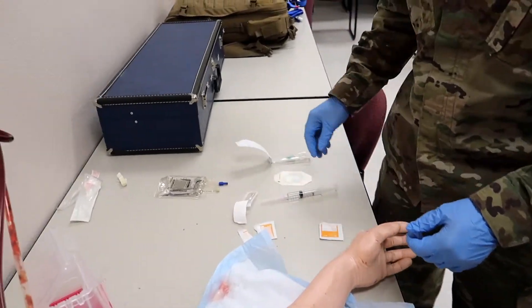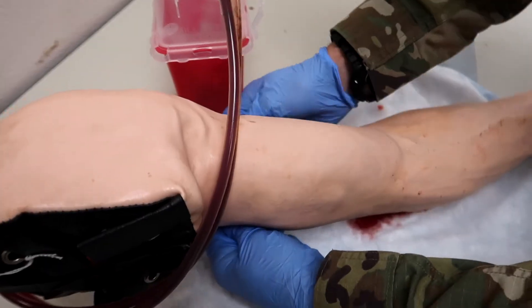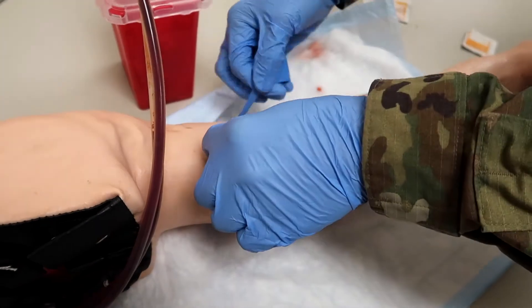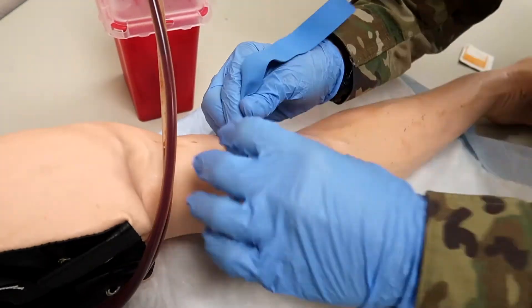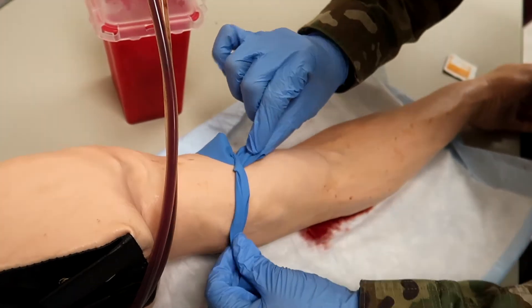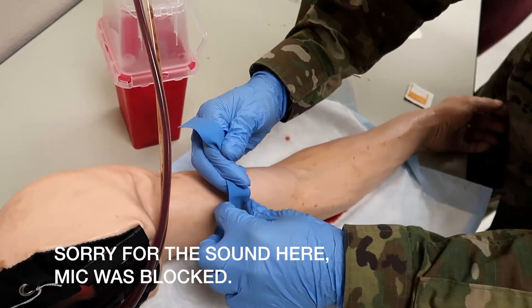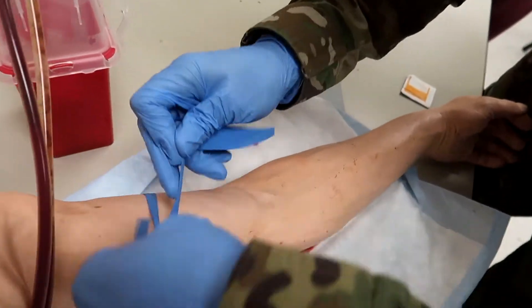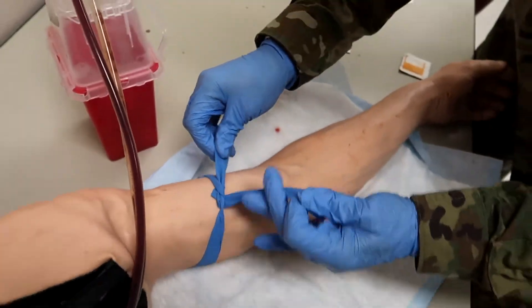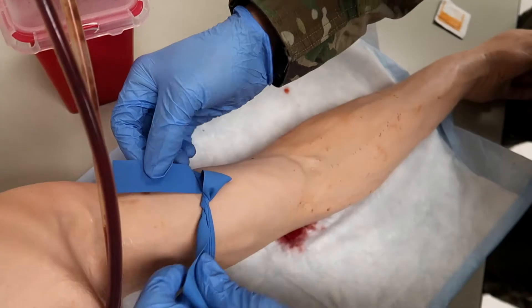Now that he's gathered, inspected, and prepared his equipment, he's going to apply the constricting band to the casualty's arm. For the constricting band, make sure it's as tight as possible — it's going to pop those veins out. Make sure the bottom band goes over and comes out just a little bit for your quick release. You don't want to go the other way, because if you do, those bands are going to get in the way of your sticking side. Bottom over under — that's set up nice.